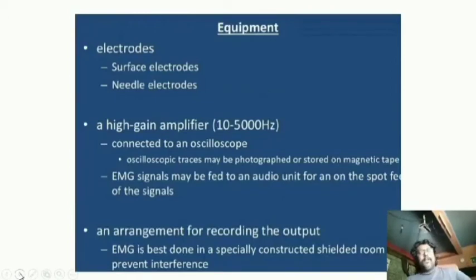And as I told earlier, EMG is a very tiny signal, looks almost like noise. So shielding that particular room is very, very important, because there can be interferences which can spoil the original signal, and that can make the analysis extremely tough. So interference is absolutely not permissible, so we have to protect the particular room by using shielding.